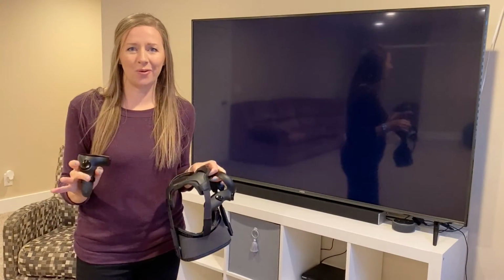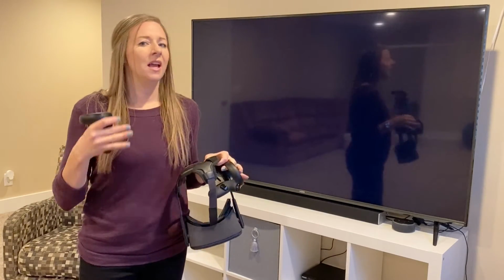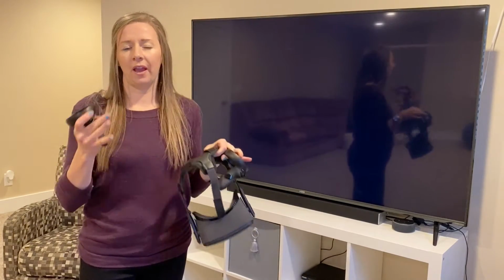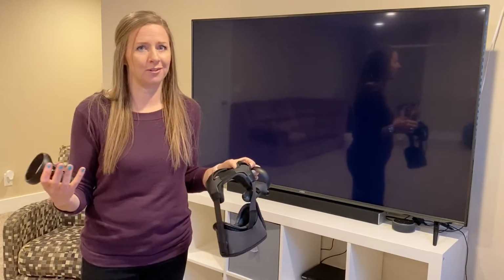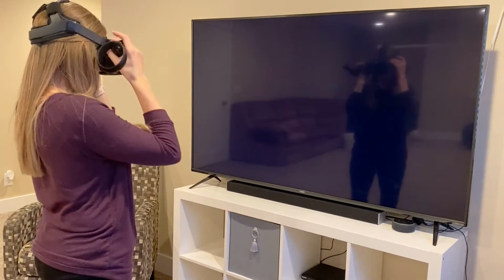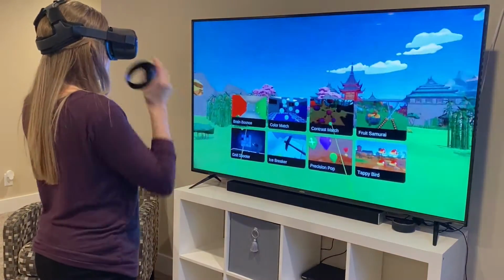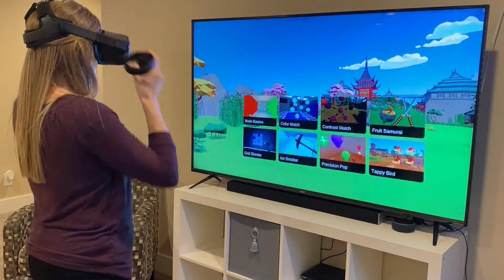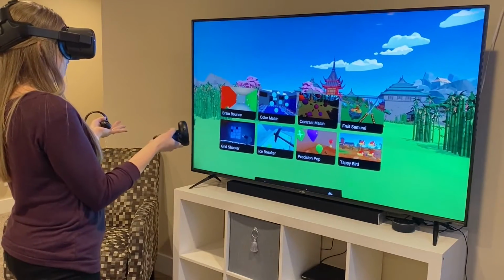Okay, so we're gonna go inside Optics Trainer. I'm gonna show you around the main menu, what that looks like, and show you a couple of the games so you can kind of get a feel for how the program works. So let's get started. All right, are we there? Okay, you can see what I can see. So this is the main menu area of Optics Trainer.